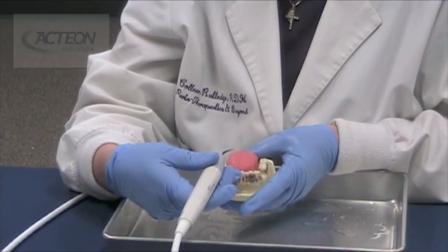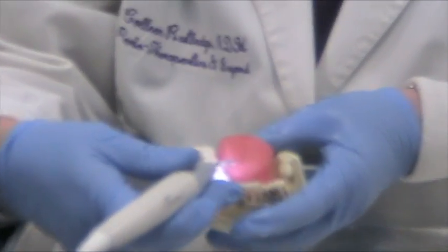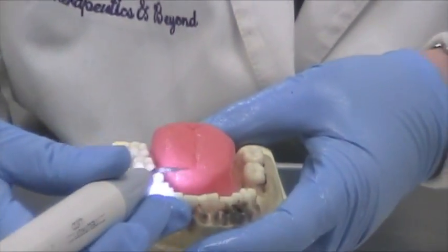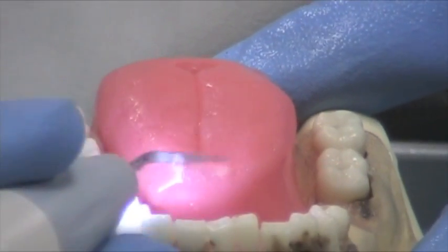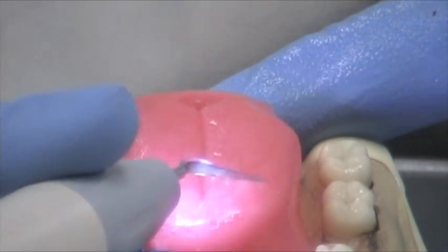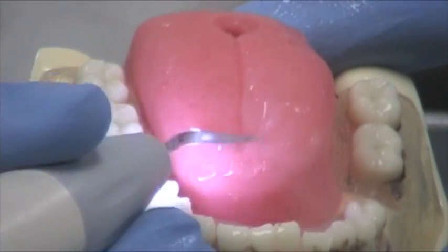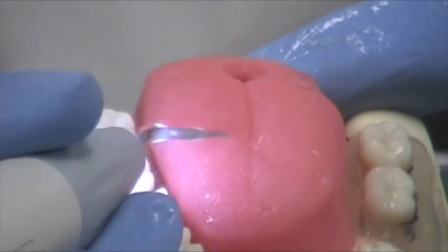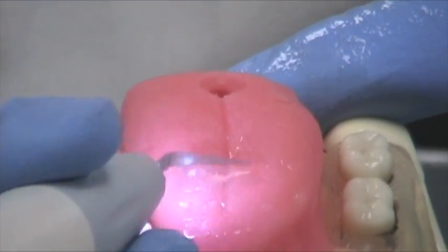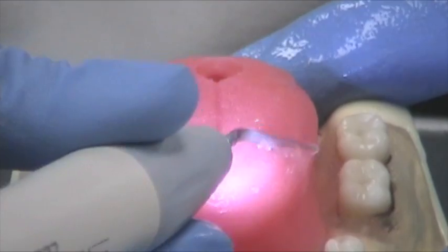Another use for the 10X tip is tongue disinfection. That's right, tongue disinfection. You start at the tip of the tongue, and you don't want to use the point — you want to use the lateral sides. You just do sweeping motions back. Now you're probably thinking, is my patient going to gag? And believe it or not, they don't. We all know the gag reflex is on the top, so you really don't go near the gag reflex at all.